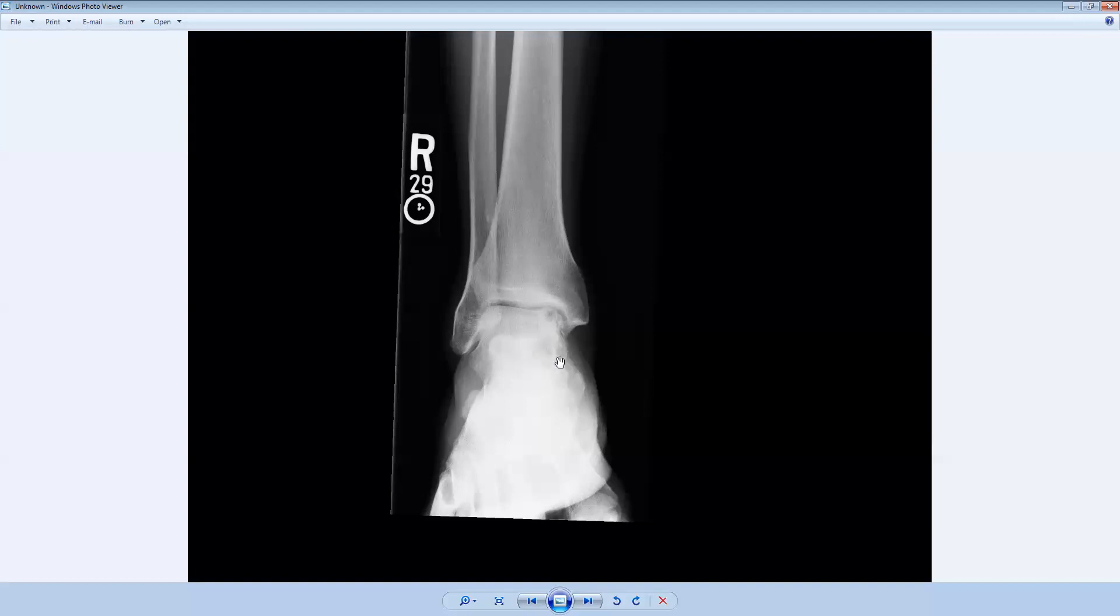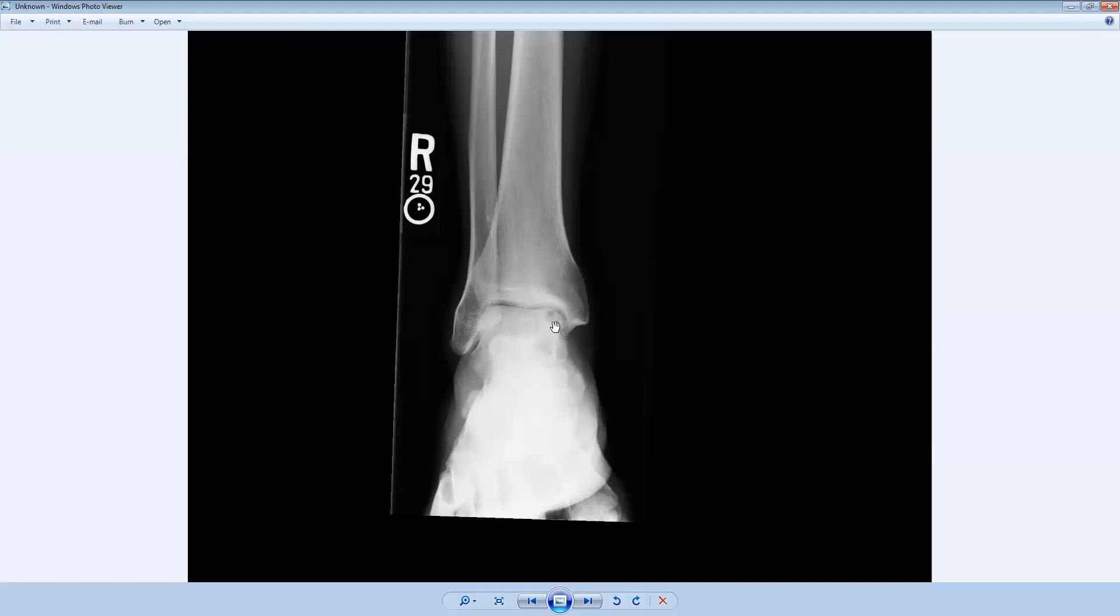What this is, in fact, is very classic in a 23-year-old athlete who's complaining of chronic pain. This represents nothing other than an osteochondral injury or an osteochondral defect. An osteochondral defect is exactly like its name implies: osteo for bone and chondral for cartilage. It's an injury to the underlying bone and cartilage here along the medial talar dome.